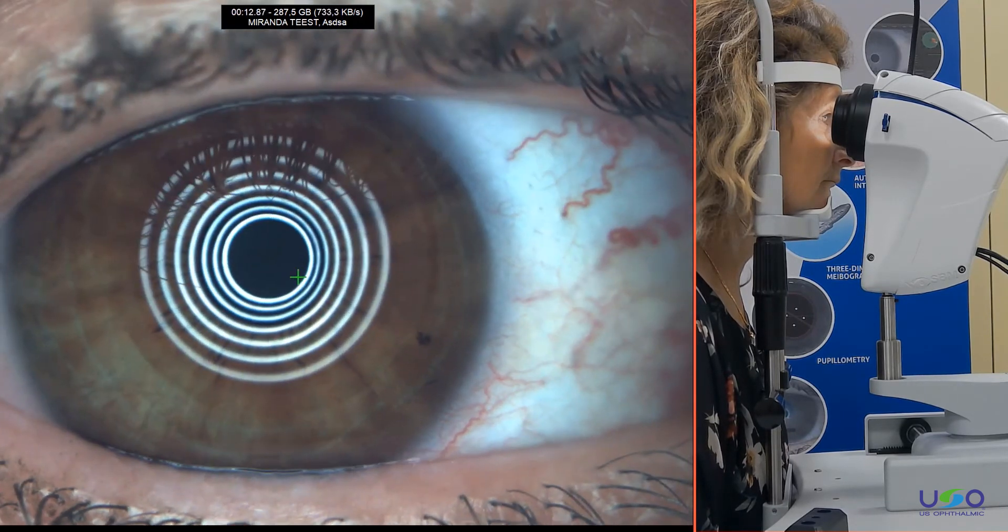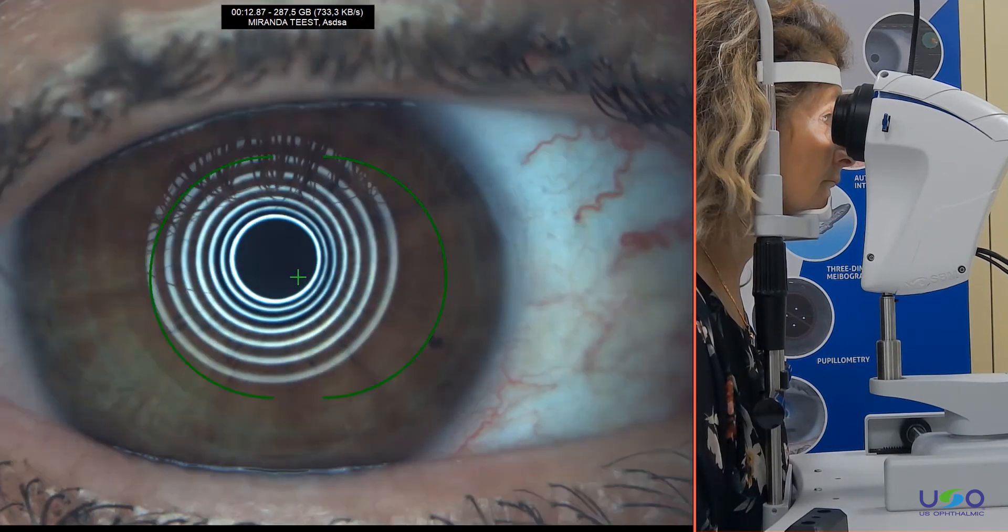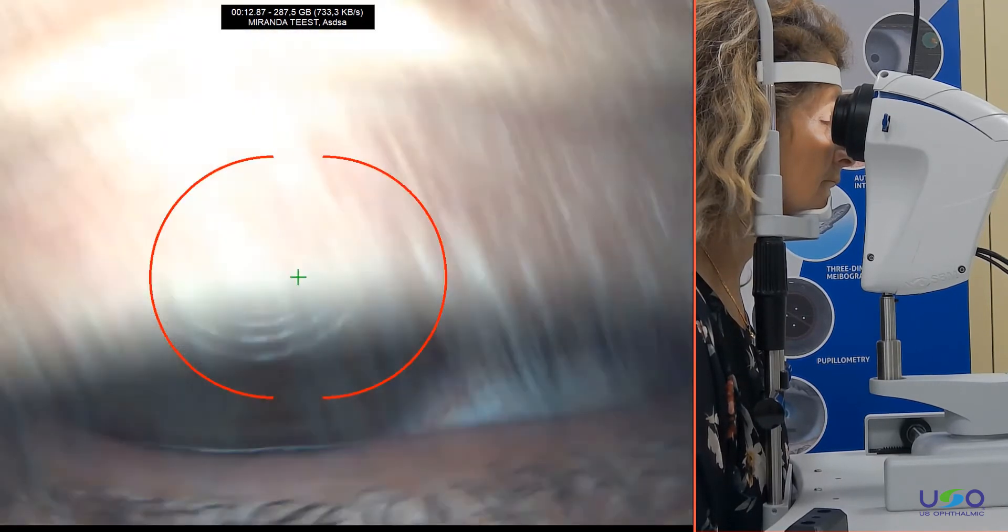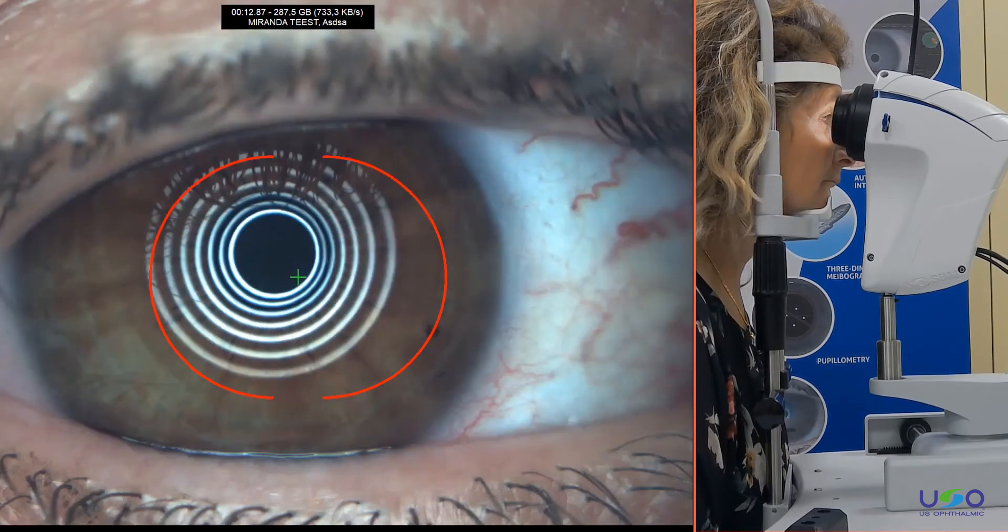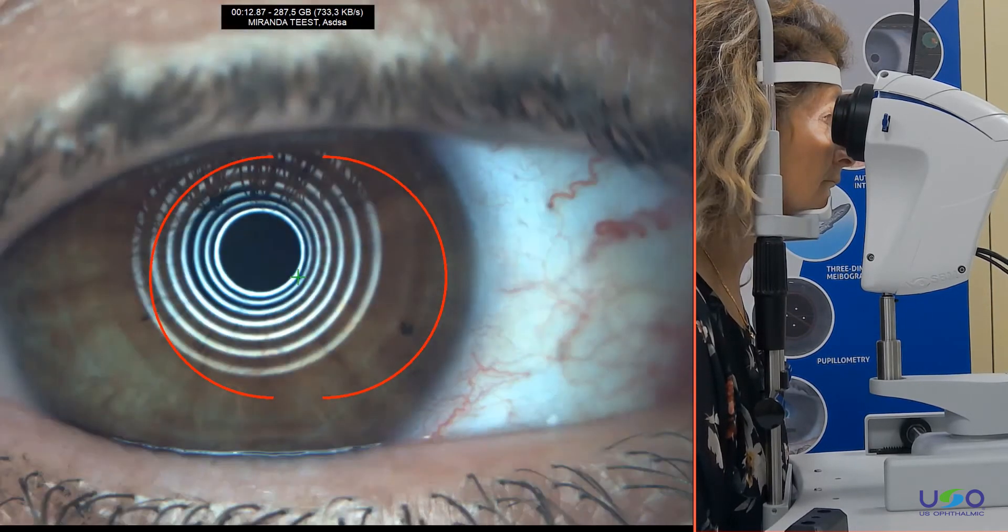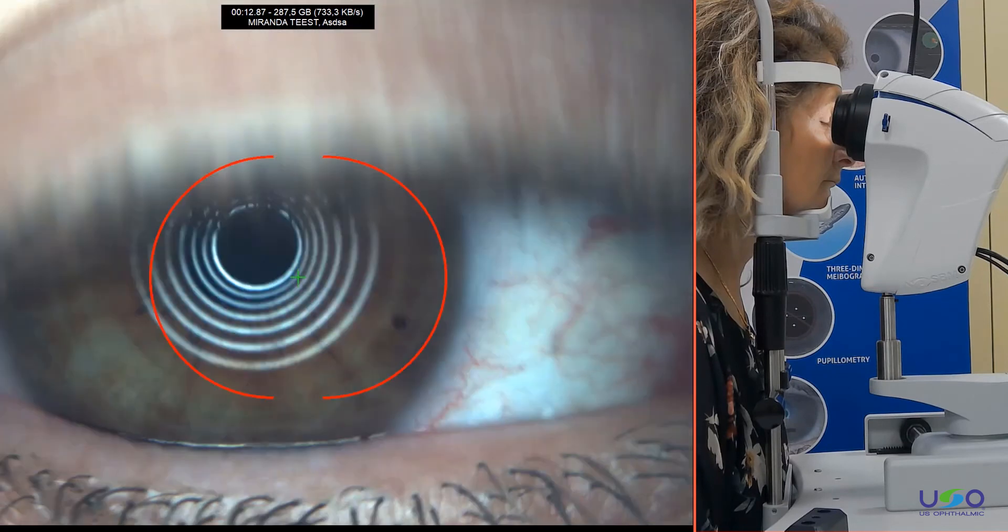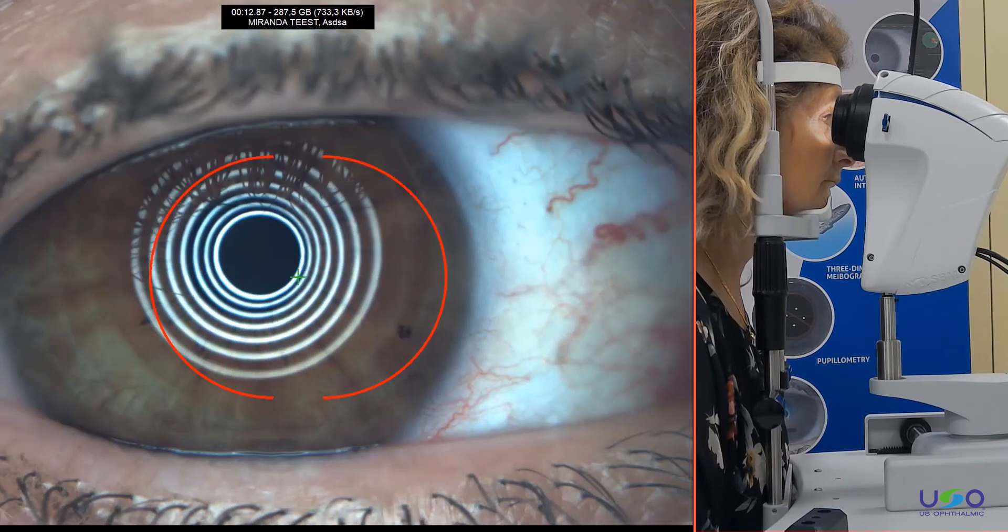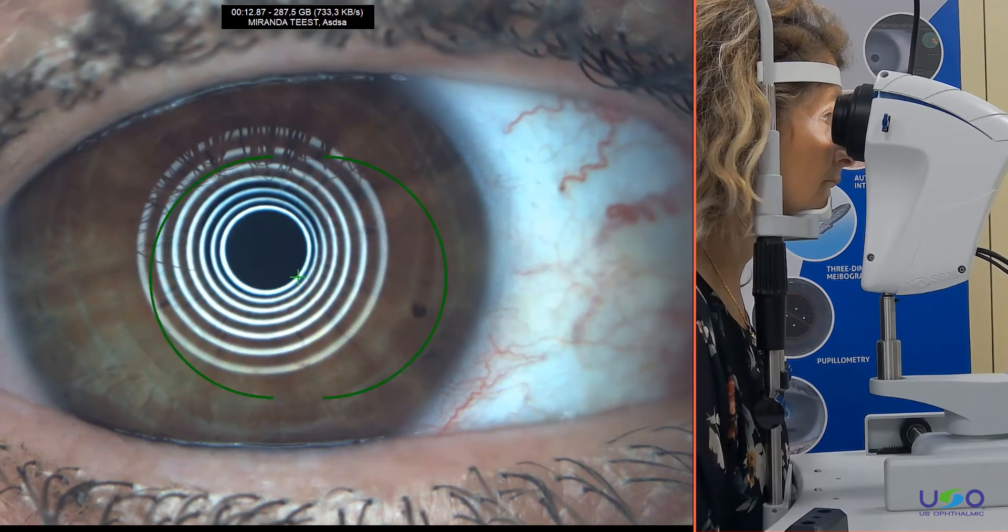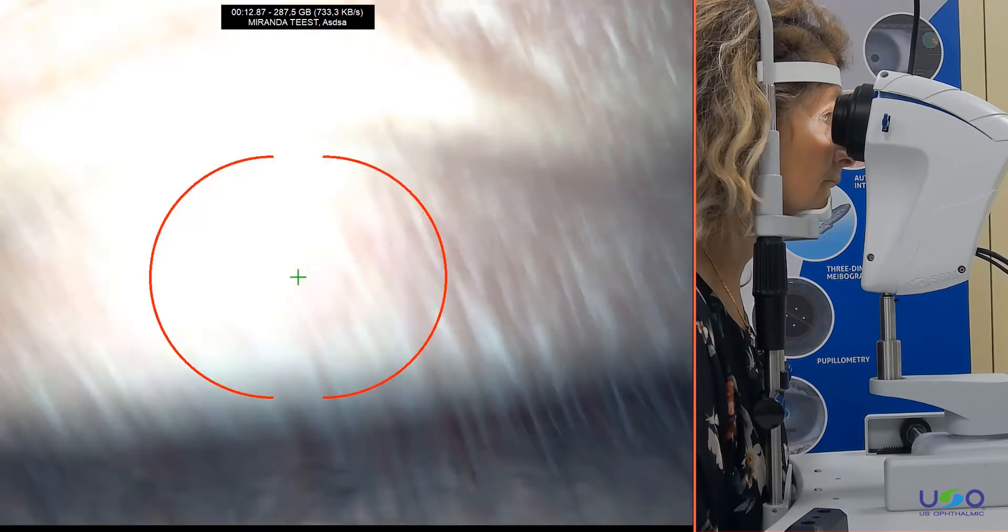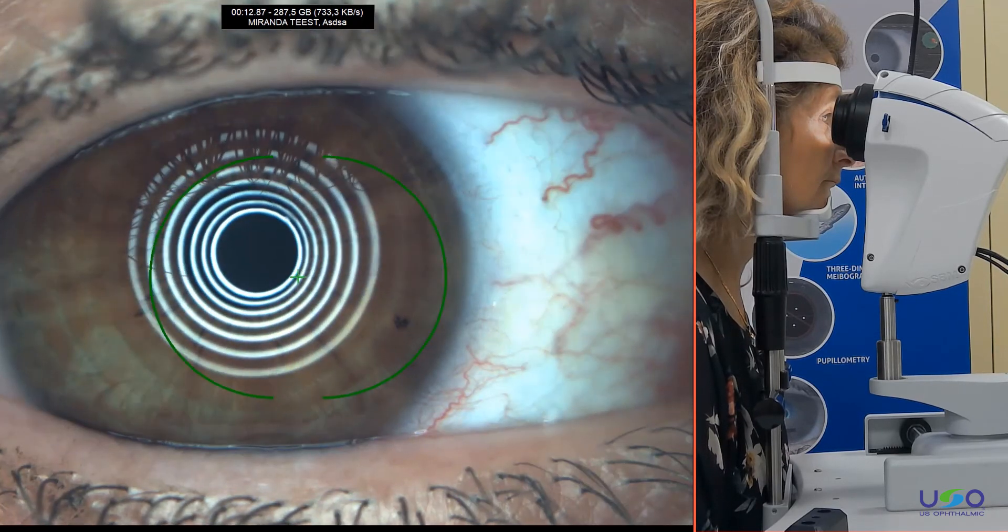So it's very important. Don't force your patient to keep the eye open for 25 seconds. It's useless. Because the software will detect the first breaking, and when the patient blinks, it means that the nerves were telling that she was not safe to keep the eye open. So it's good to let her blink whenever she wants.